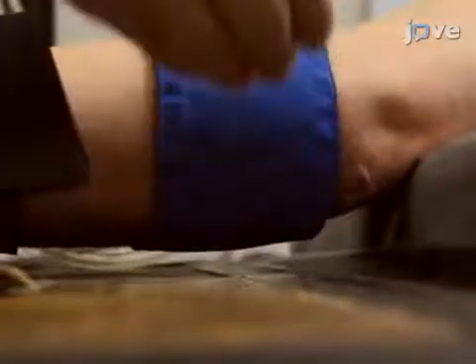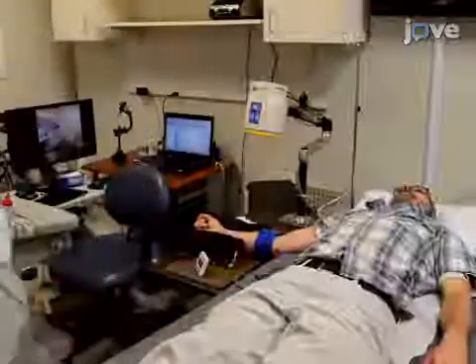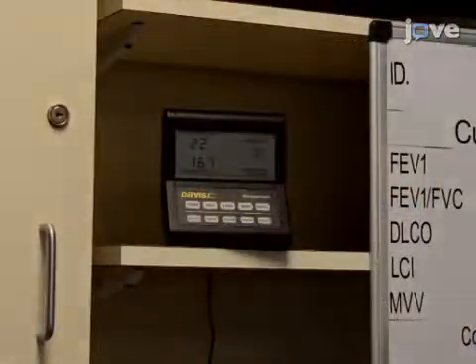Take care that nothing is touching the cuff, including the table. The subject should then rest in the supine position in a quiet, temperature-controlled 22 to 24 degrees Celsius room for approximately 20 minutes.